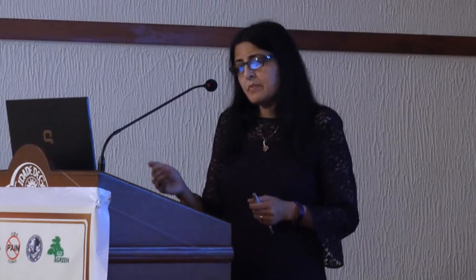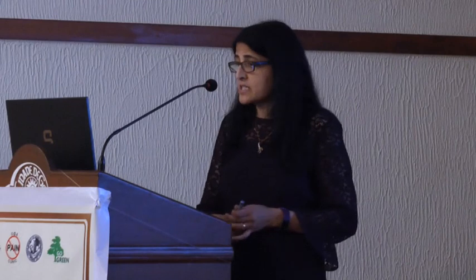It is very crucial you stabilize your needle very carefully when you're inserting your catheter. You may want to inject 2 or 3 mL of local anesthetic as you advance the catheter. It just makes it a little bit easier. While withdrawing the needle, again, be careful not to dislodge the catheter. Once the catheter is in place, about 3 centimeters within the sheath, then you can secure it. You can either tape it or you can tunnel it. Tunneling is advised when you're going to keep the catheter for a long time.